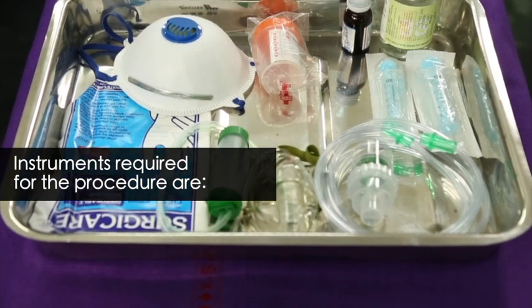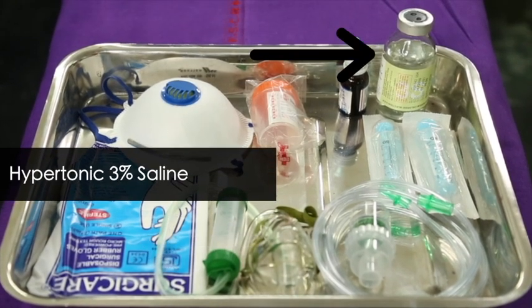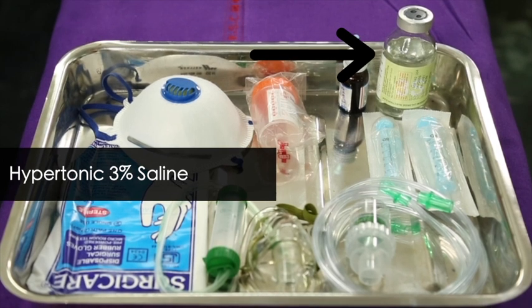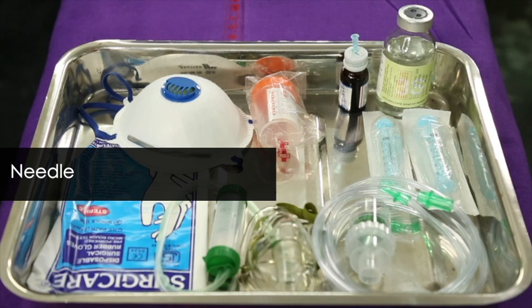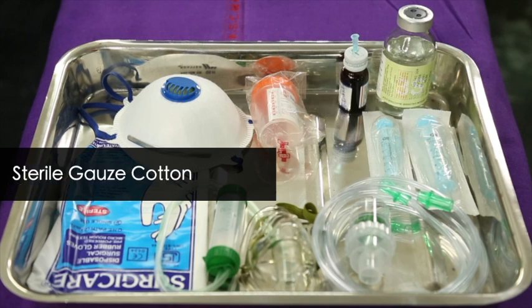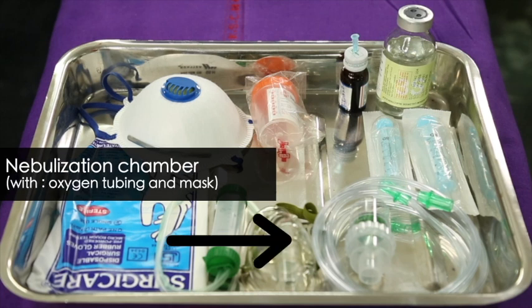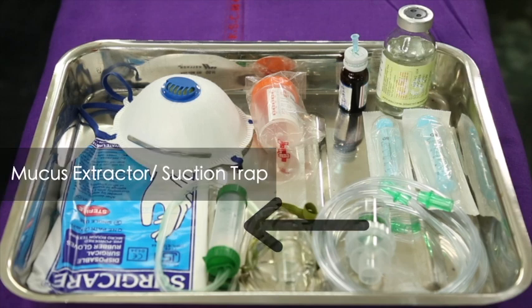Instruments required for the procedure are disposable gloves, hypertonic 3% saline, a 10 ml syringe, needle, adhesive tape, sterile specimen container, sterile gauze cotton, nebulization chamber with oxygen tubing and mask, salbutamol, and mucus extractor or suction trap.